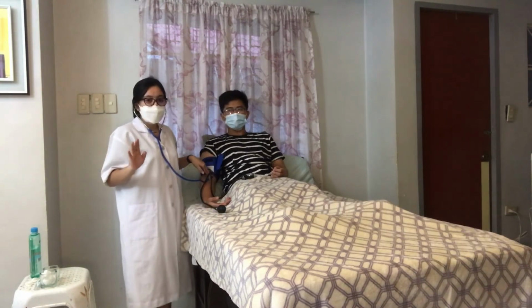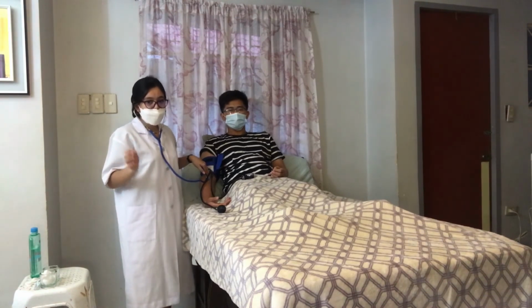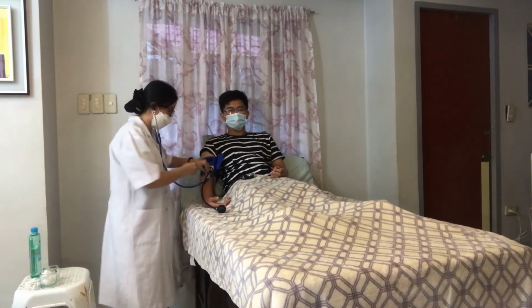After that, we are going to remove the cuff from the client's arm and assist the patient to assume a comfortable position. Cover the upper arm if it was previously clothed.